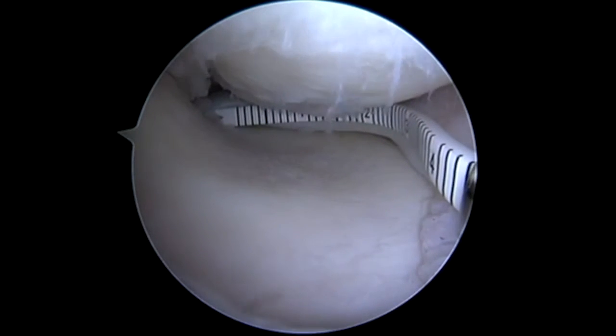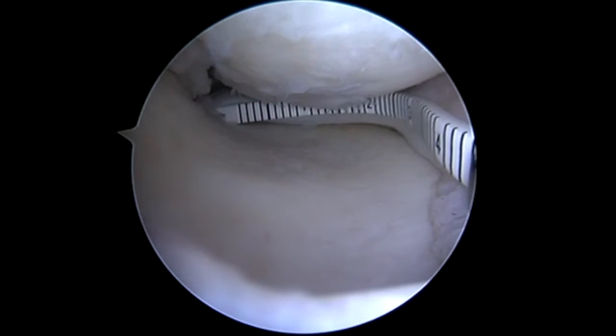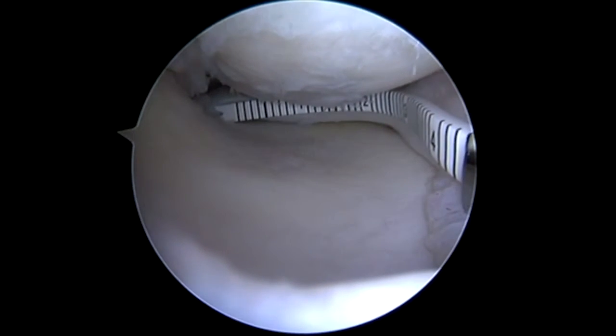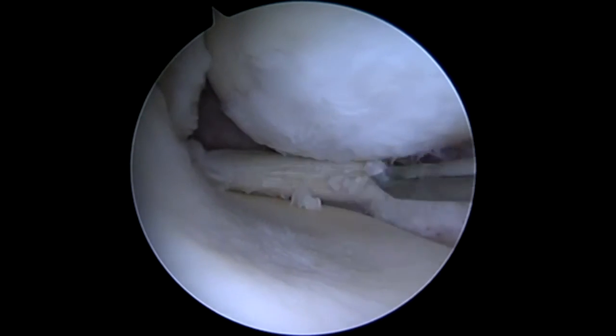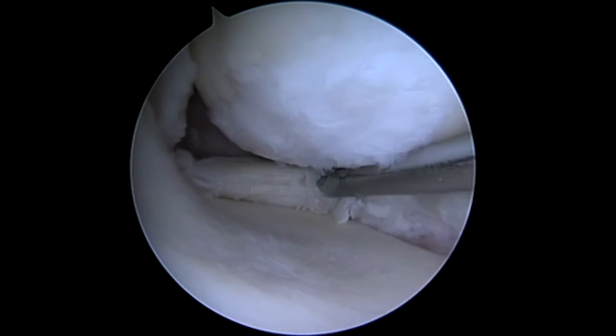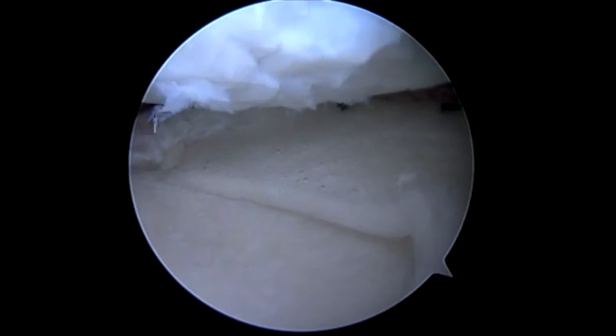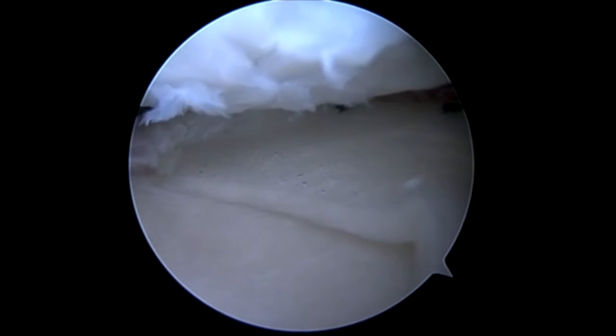Hi, this is Dr. Chris Storty. We're covering the use of the CMI or collagen meniscus implant by IV Sports Medicine for meniscal defects. This patient had previously had a cartilage grafting procedure on his medial femoral condyle but had volume loss of his medial meniscus. He continued to experience pain, and with his volume loss we felt it best to go ahead and replace that volume loss of his medial meniscus.